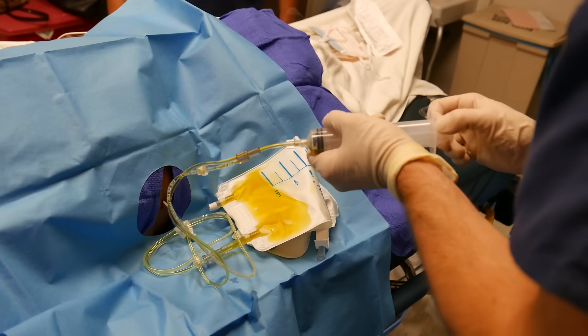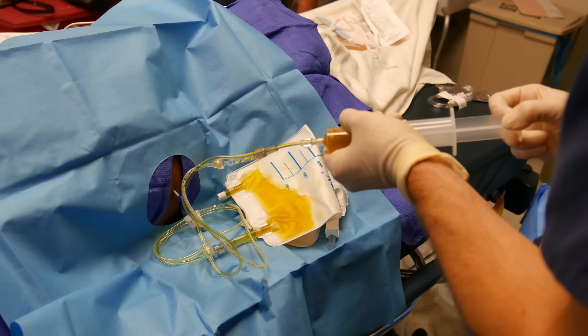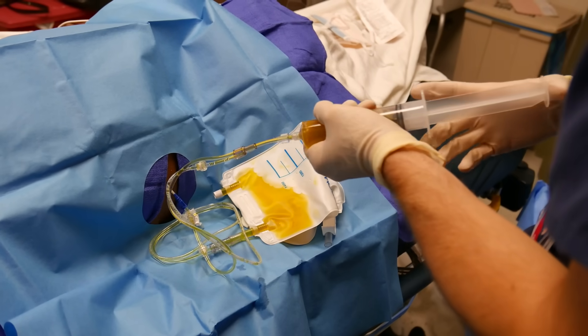When you press the plunger it's going to push fluid into the bag. Perfect — now you get to stand there for two hours and evacuate the fluid. You didn't want to go home tonight, did you?